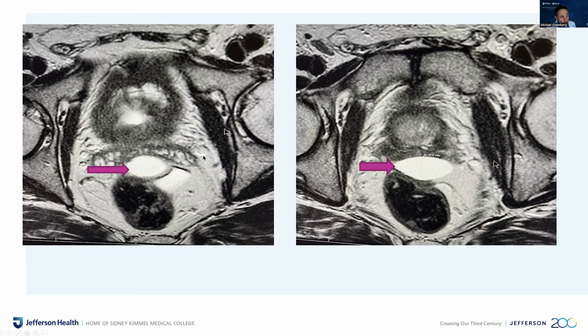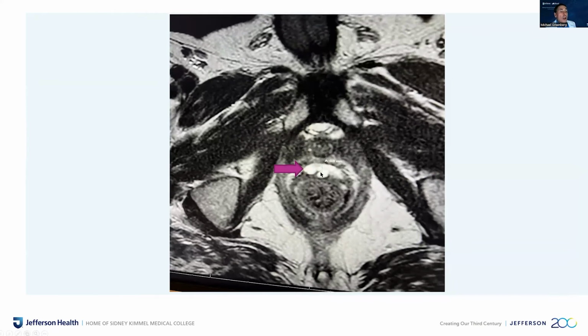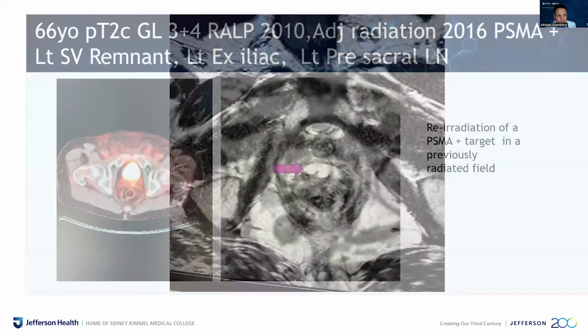So here, these rabbit-like structures just above are called the seminal vesicles. So we can get this barrier or gel very high. And as we work our way down, you can see now we're just at the base of the prostate. We still have very, very good displacement. Here we're getting down towards the lower part of the prostate, or what we call the apex, and still very, very good displacement, as you can see on the arrow. And here, all the way down below the prostate, we still have displacement, which absolutely gives us protection of the anterior rectal wall all the way down below the apex.